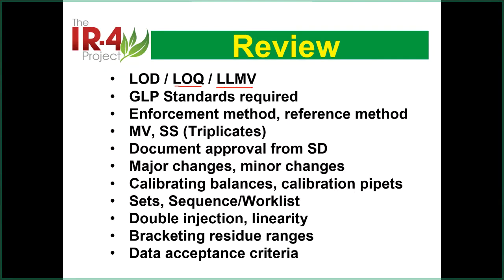In the IR4 system, based on the EPA requirement, at the LLMV level we need to do at least 6 samples. This is the IR4 system, but a different country may have a different requirement. I know some countries require 7, because that's easier to calculate using the student t-test constant, which is 3.14. So when you do the work, check the requirements.